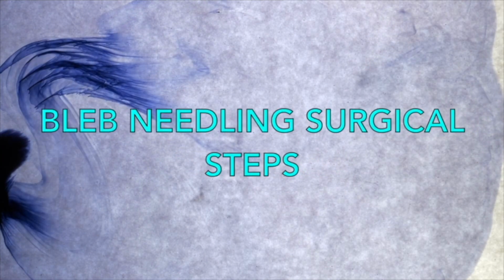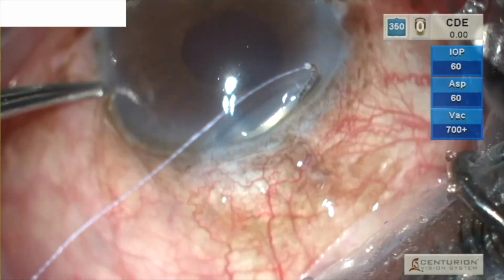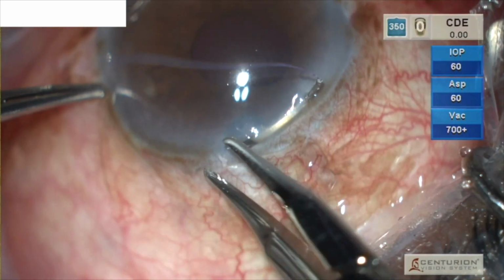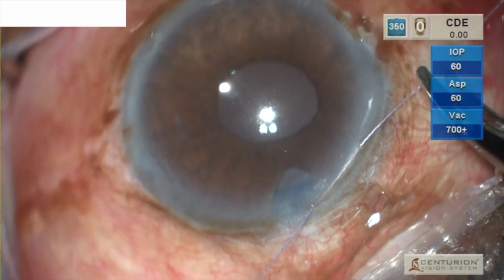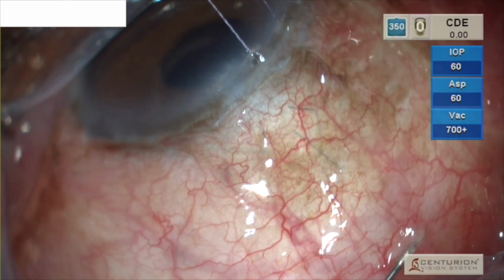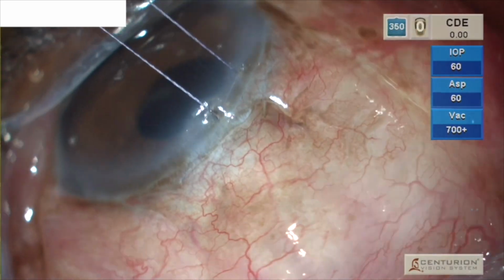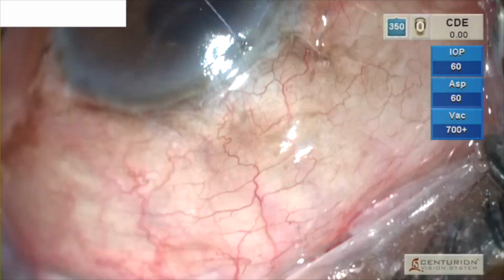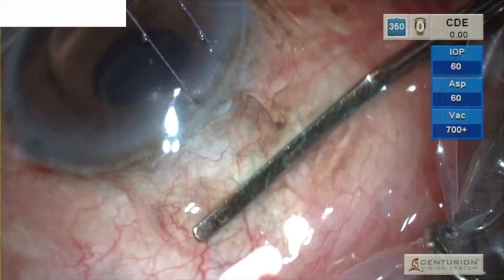Now let's see the steps of bleb needling. To start, MMC is injected 6 to 8 mm behind the limbus. A spatula is used to prevent further migration anteriorly.